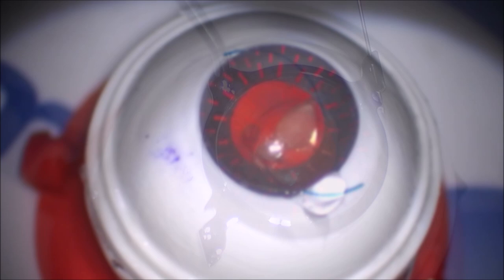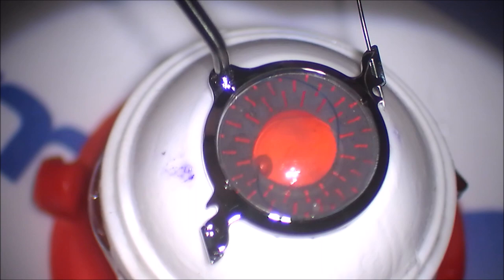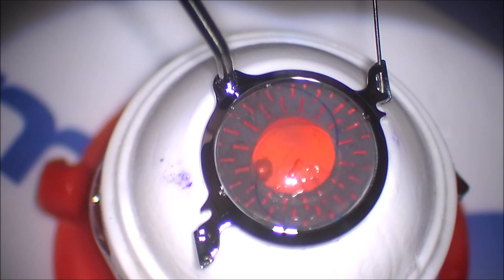As you can see, I'm engaging the 30 gauge thin wall needle through the device. You can see it's got this little tracking platform that you're supposed to push. And it goes in at a certain angle through the sclera. So in this case I did not bend the needle. I just kept it straight. Again, this is a fake eye. And I do the same thing on the other side.